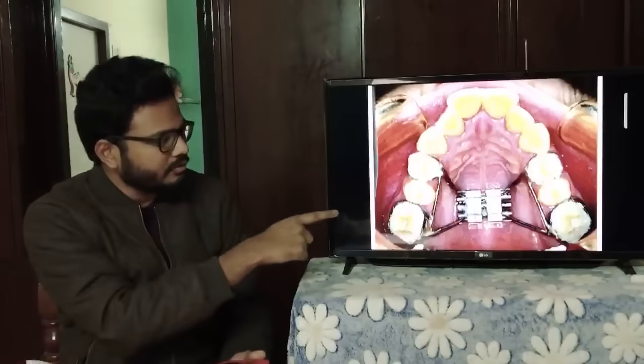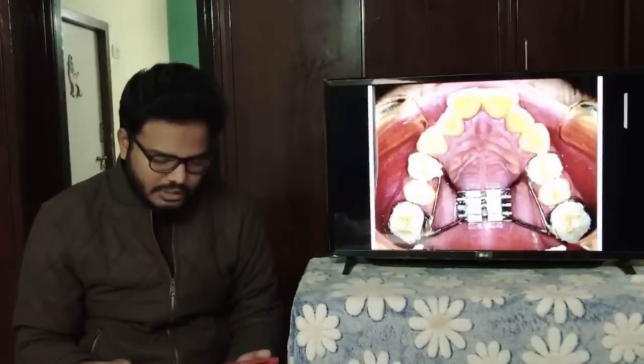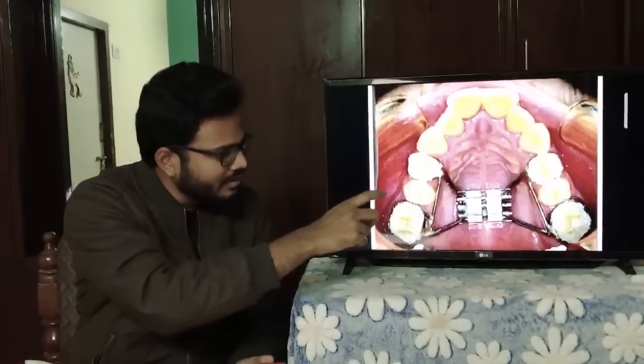So we have maxillary expansion devices, soft tissue borne and tooth borne. This is a tooth-borne appliance, the Hyrax appliance, a special kind of screw with soldered wires conforming to the palatal contours of premolars as well as molars. You can see the banding of premolars and molars. Rapid maxillary expansion, Hyrax, hygienic rapid expander. It's a single screw system. This entire thing is considered to be a screw. This particular unit is called Hyrax.